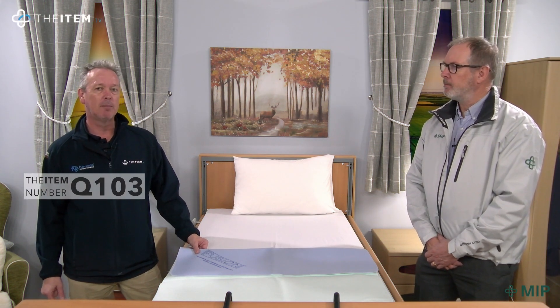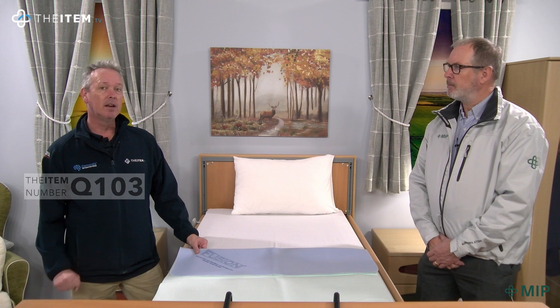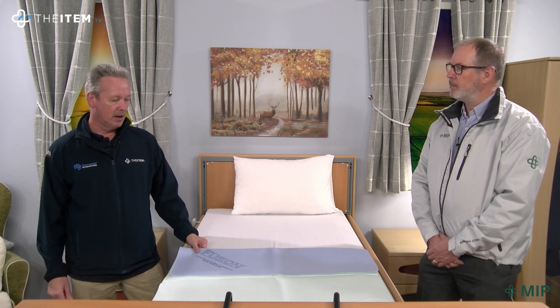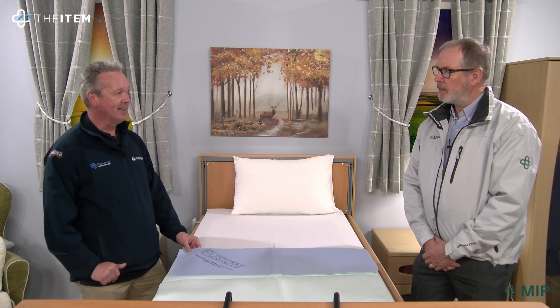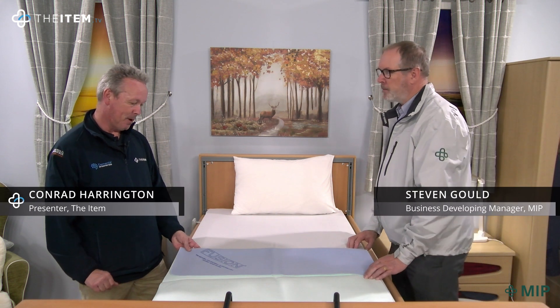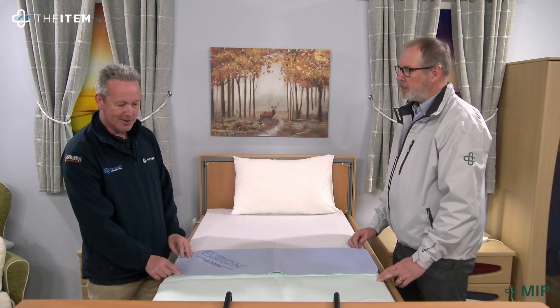This is item number Q103, the Fusion Bed Pad from MIP. Here with me is Steve Gould from MIP, and he's going to tell me a little bit more about this bed pad and what makes it so special and much different from the others. I see you've got the Fusion Bed Pad here — it looks quite amazing, it's incredibly thin. So tell me more about it please.